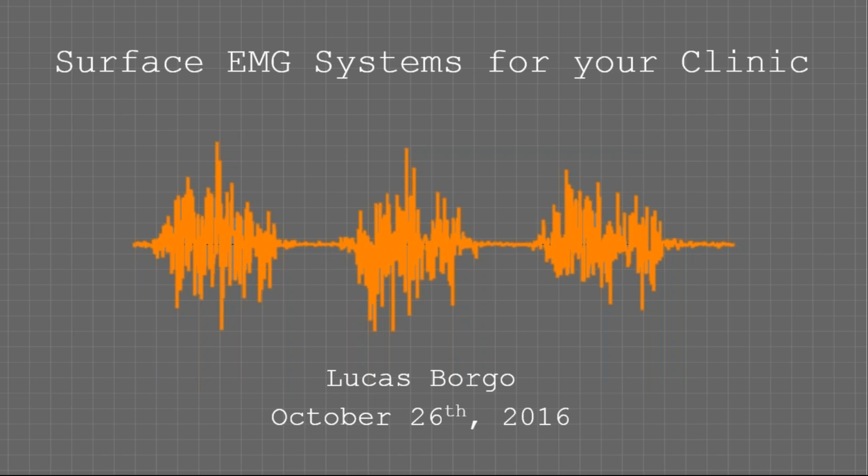What we're planning to do is take a look at some sEMG systems for clinical use. My name is Lucas Borgo. I work for Thought Technology, a biotech company that designs the hardware and software around signal acquisition and biofeedback.